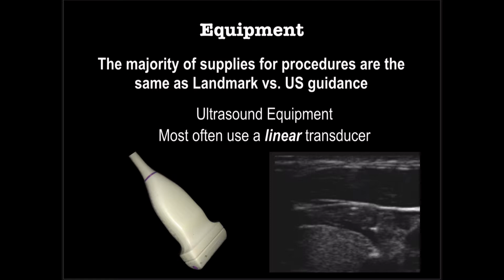Now we're going to use our other transducer. Before, we talked about the phased array or cardiac probe, which is what we use for the abdomen and the heart. This one, we're going to use your other transducer, which is the linear transducer. We're going to use this linear or flat-faced transducer, and it produces this square or rectangular image. And the reason why we do that, a couple of reasons. One is the linear or flat-faced transducer is high frequency.